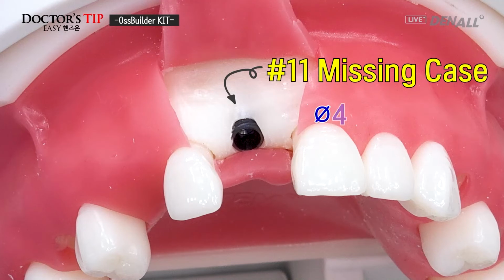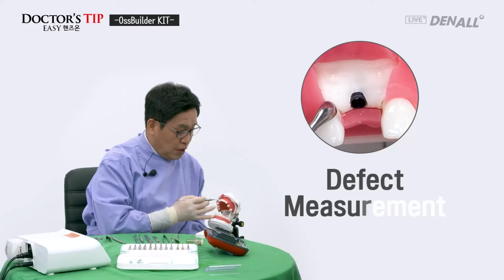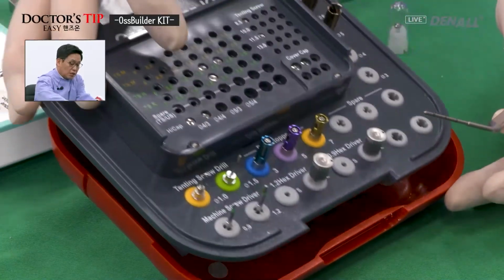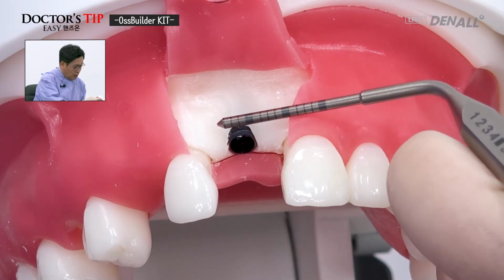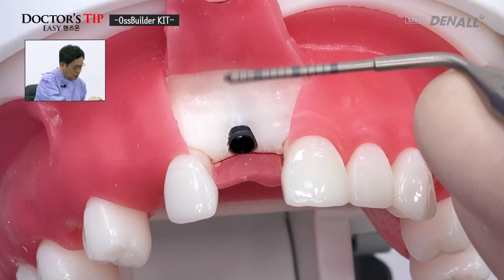OssBuilder KIT related hands-on practice will begin. Number 11 is missing. A TS3 diameter 4.0 by 11.5 millimeter implant has been placed. After that, using OssBuilder, GBR will be conducted. In order to check the defect, I'm going to use the OssBuilder KIT. On the bottom, there is a gauge. There's a defect gauge, and using this, we can assess the defect. And you can also measure vertically.